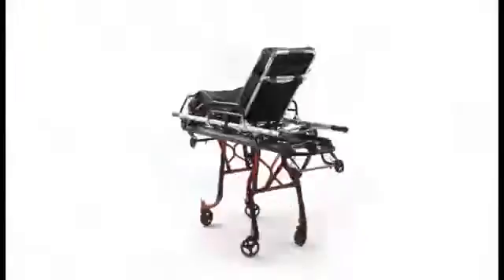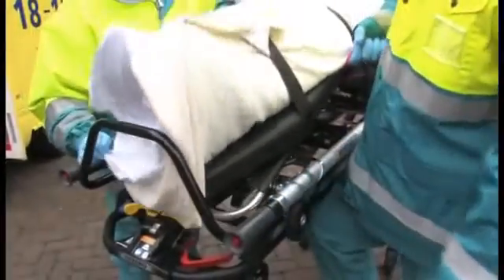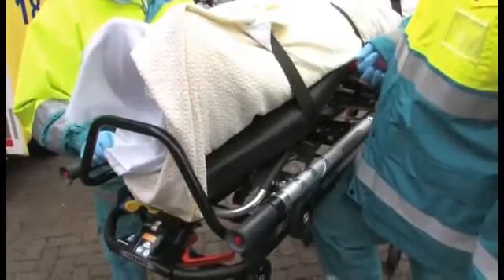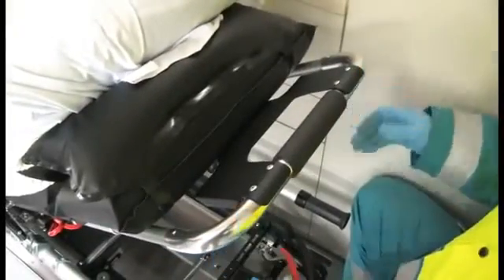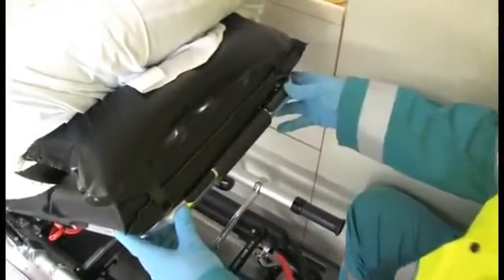For patient comfort on long transports, engage the contour position. Lift up on the red contour position handles in the center of the panel until the panel locks into place. To lower the contour position, lift up slightly on the end of the foot panel, press the foot end tabs, and lower the contour position. To extend the headrest for taller patients, grab the head end bar and pull out until it locks. To retract, push in until it locks.